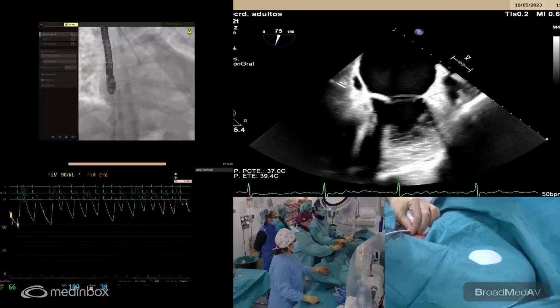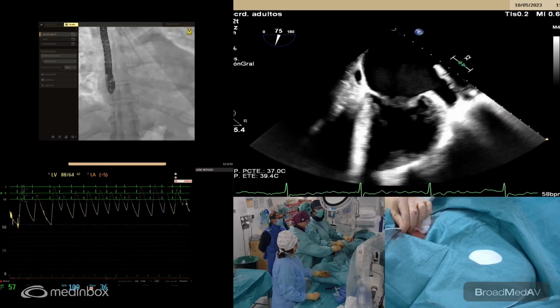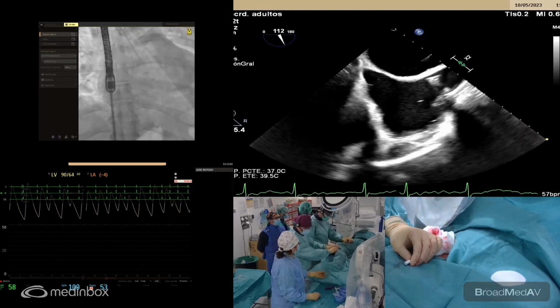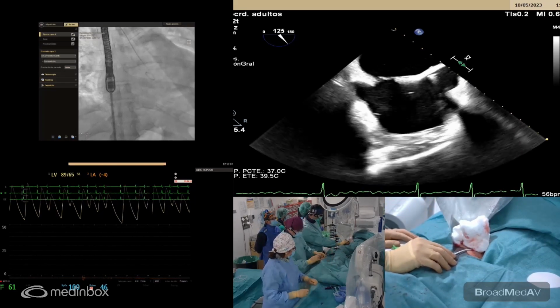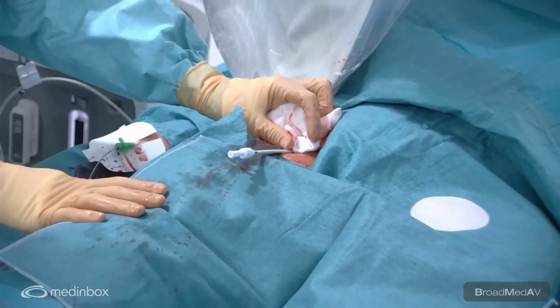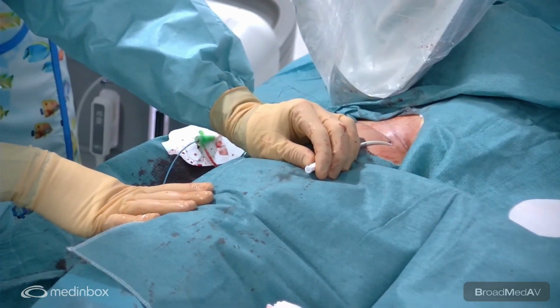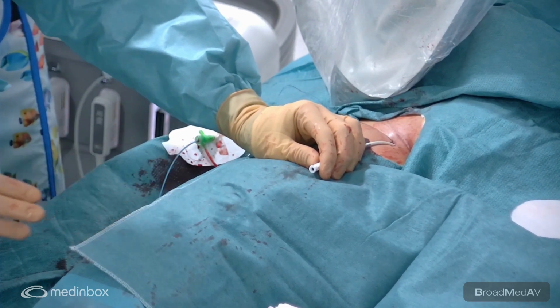Alfonso and Guillermo. Okay, thank you, Silvia. We have another comment of the echo. You see some funny smoke in the left atrium. We have now administered a slight dose of heparin before the transeptal puncture. We do it in every case. And now I'm going to update the setup. We have a 6 French radial sheath just to have a pigtail in the aorta, and we did echo-guided puncture of the femoral vein, just to use one ProGlide. We use it when we go with sheaths over 14 for the final closure.